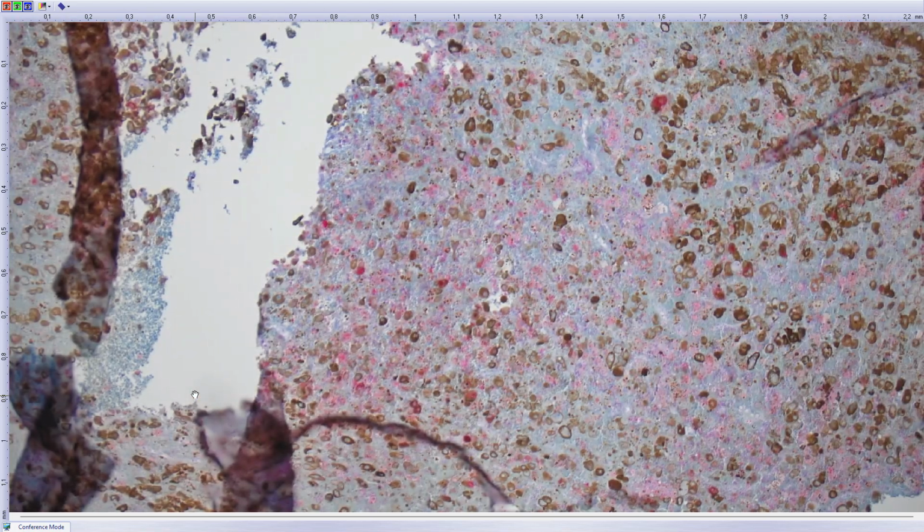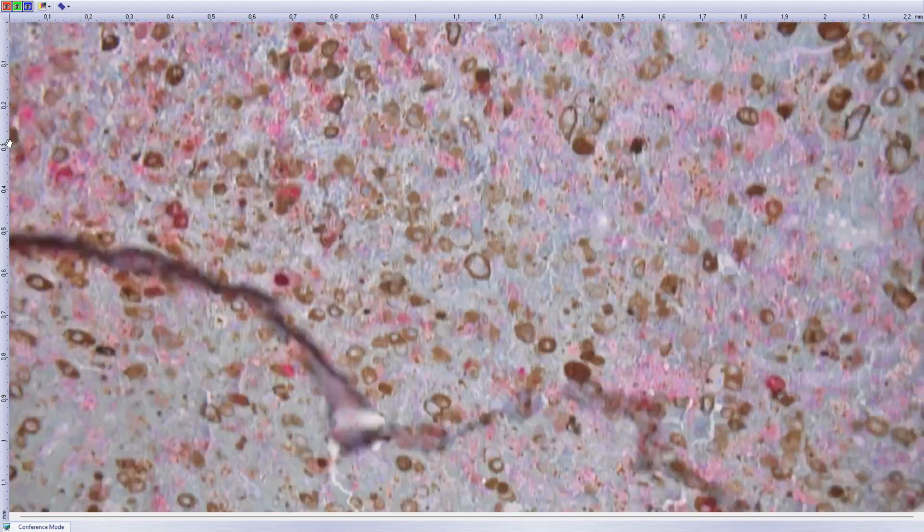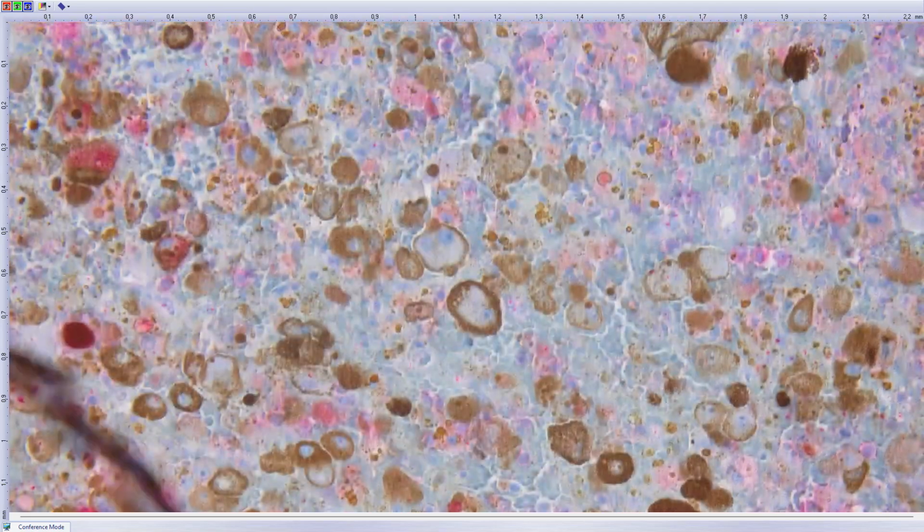Again, this tumor is in some patients associated with Carney syndrome or Carney complex. I never know the Carney complex. And PRKAR1A staining is a cytoplasmic staining. And there is typically loss in the tumor cells and retained expression in non-tumor cells.